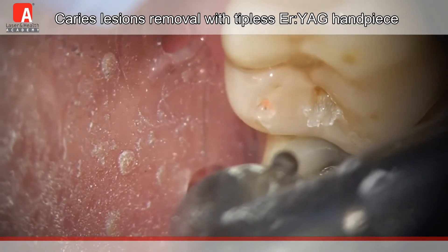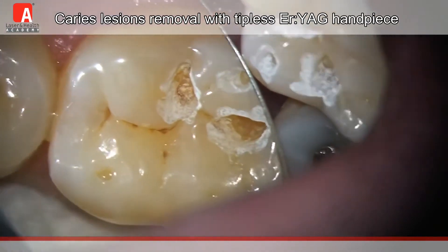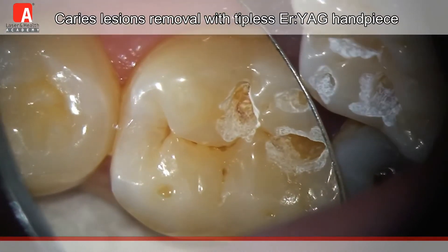And here is the final result — the removal of all the decayed tooth structure, with just healthy tooth structure left ready to be filled, and here is the final filling.